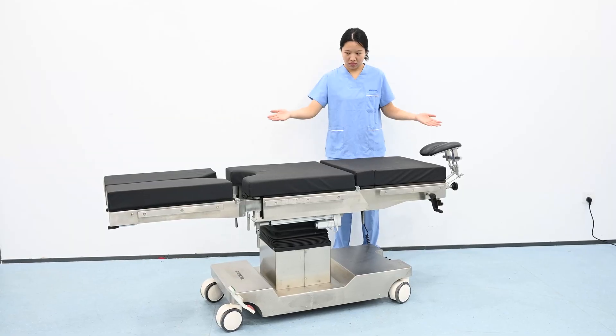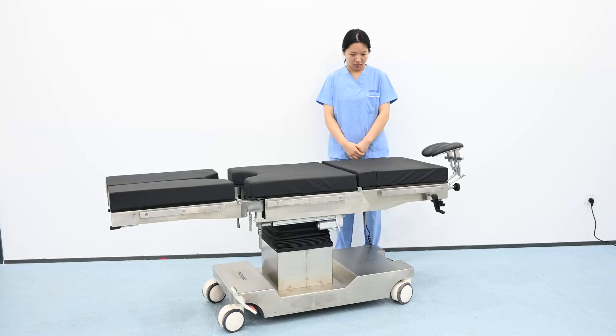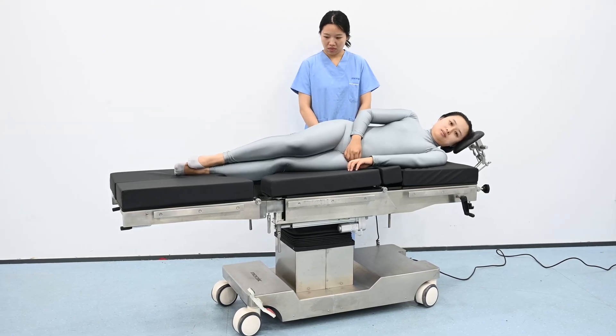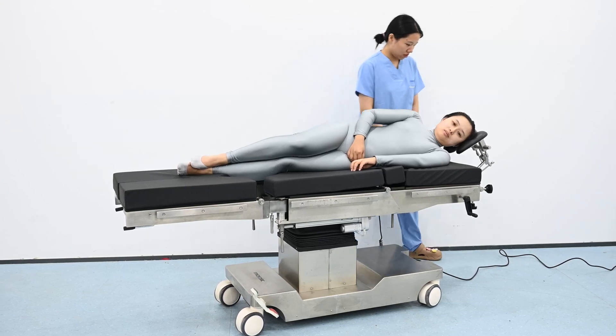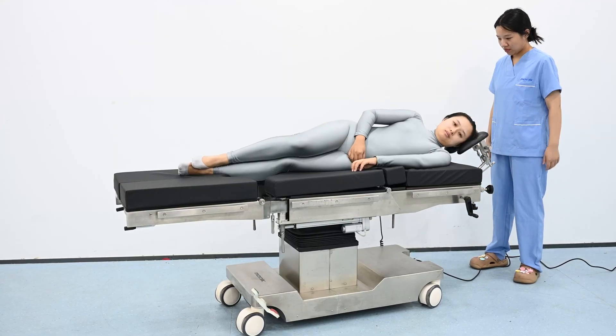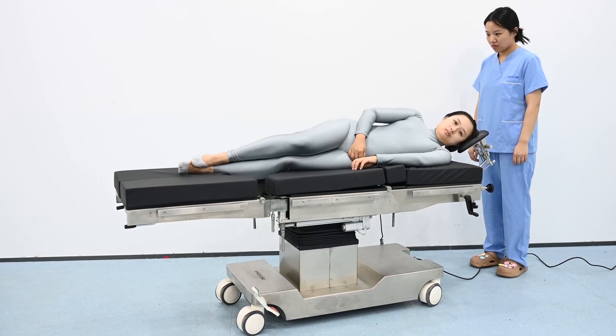Now we have the table set up to the proper length for the patient to be positioned. The patient is obviously anesthesia administered in the supine position. In this case we adjust the headrest up to meet her neck, so her neck is straight and the patient is in a safe position.